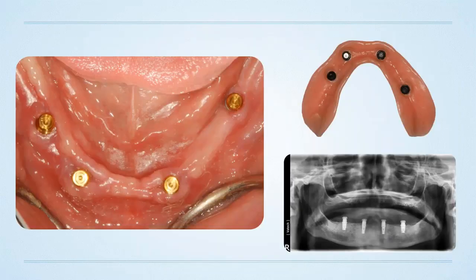This is kind of like a routine in my clinical practice, something like what you would see here on the screen. Now you can see here I've got implants approximately 19 position here, 22, 27, and this one is more like the 29 position. His 30 position was not ideal, but we were able to get a pretty good result. And you can see here across the board, bone healing looks good. You've got the locators in place.